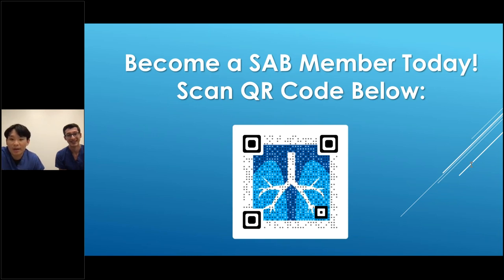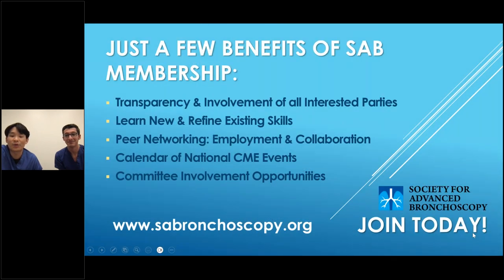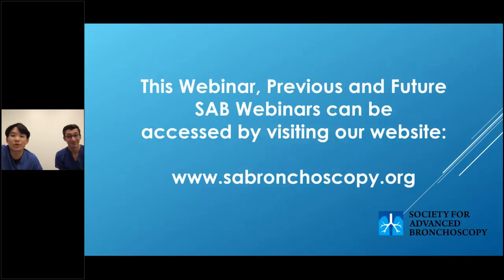Question 8 goes, are we able to bill separately when performing rigid bronchoscopy? If yes, then what CPT code? Great question. Unfortunately, our society has decided that there is no separate billing for rigid bronchoscopy. So there is no separate CPT code for rigid bronchoscopy by itself, whether for the intubation part or added with anything else. So if you do intubation with rigid bronchoscopy, for example, and for whatever reason the patient's airway looks pristine and great, and you just decide to do a BAL for concern for infection, you will still use the regular BAL CPT code that you would use for flexible bronchoscopy, 31624, and nothing else additional.